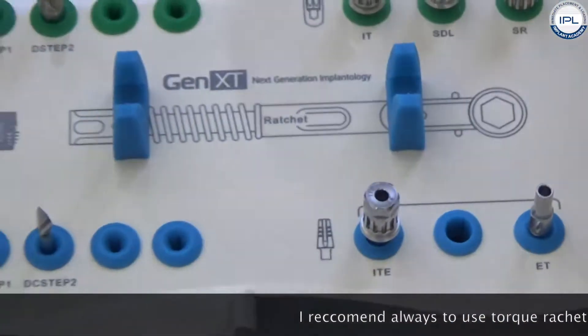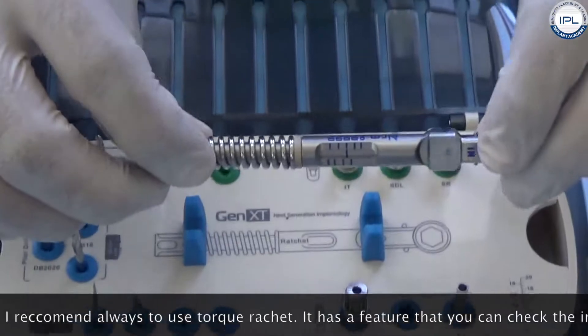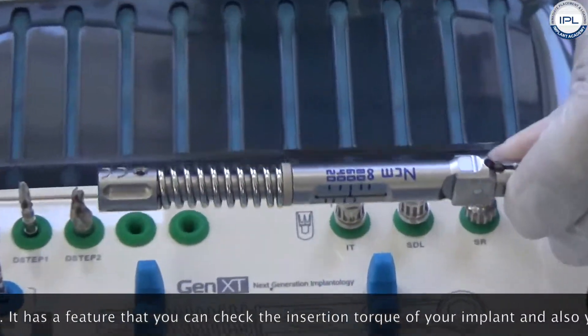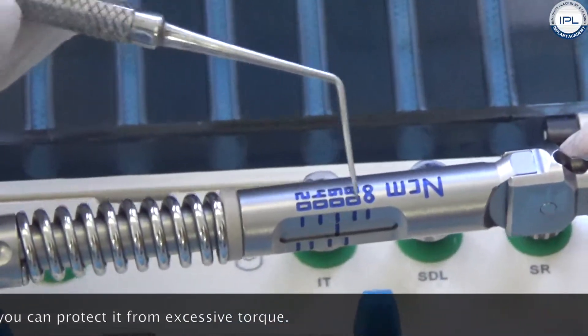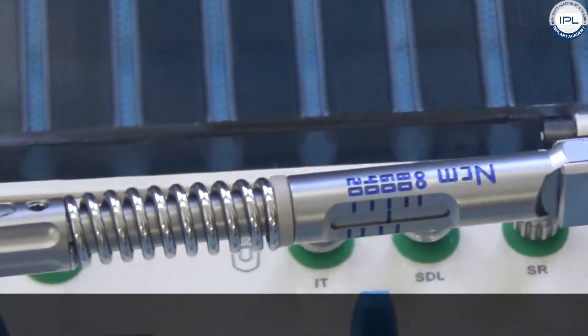As I said, I recommend always to use the torque ratchet. The torque ratchet has a feature that you can check the insertion torque of your implant and you can also protect it from excessive torque. So this is the handle over here.